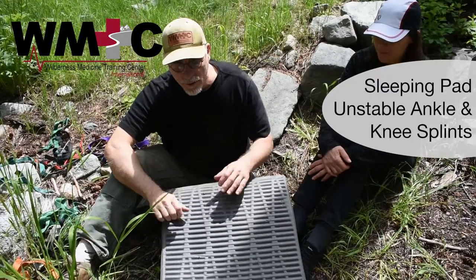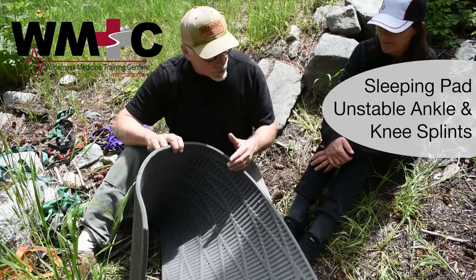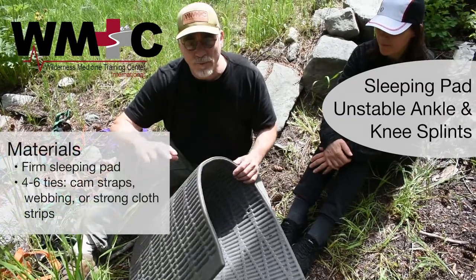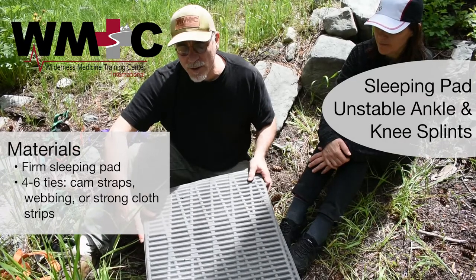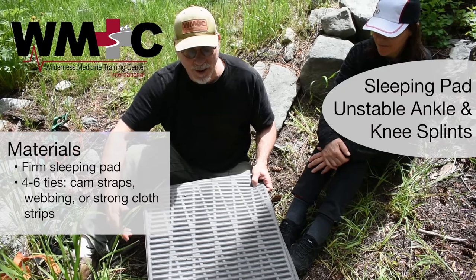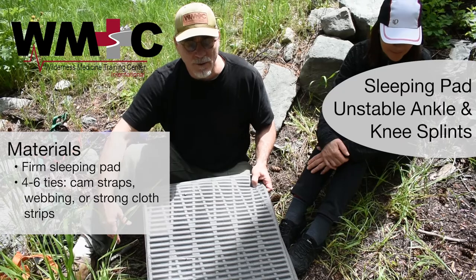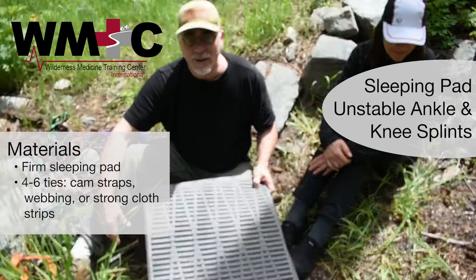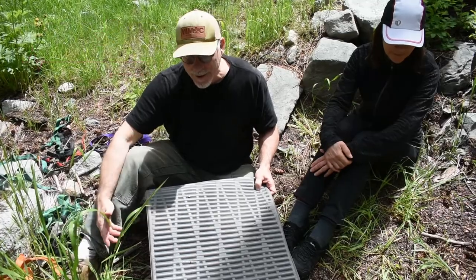In this video I'm going to show you how to use a sleeping pad to make two different splints: one for an ankle injury, one for a knee injury. Both of these are unstable injuries where the patient could not stand up and walk, so you're going to need to carry them out. This is not a walking splint, but it is a great splint for stabilizing a knee or an ankle and carrying someone out. It adds a lot of protection, it's super comfortable, and easy to do.